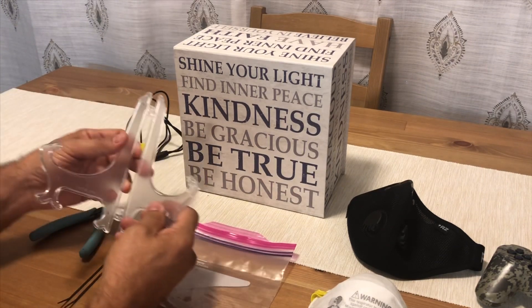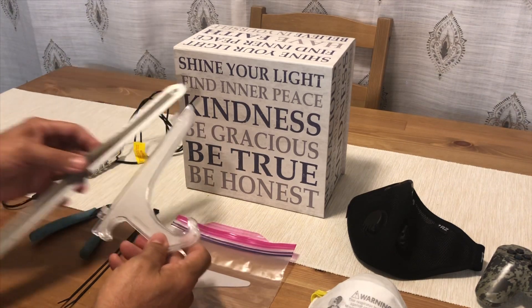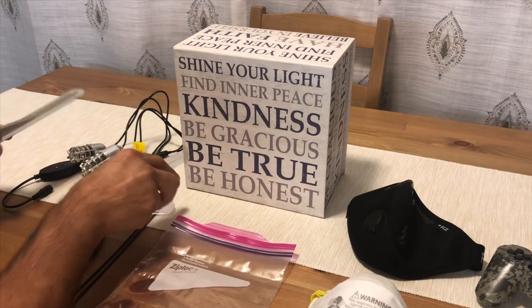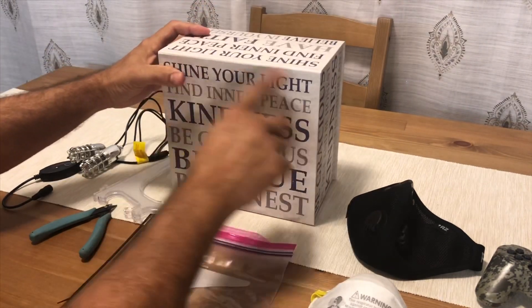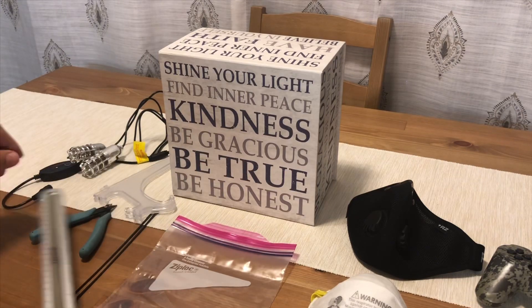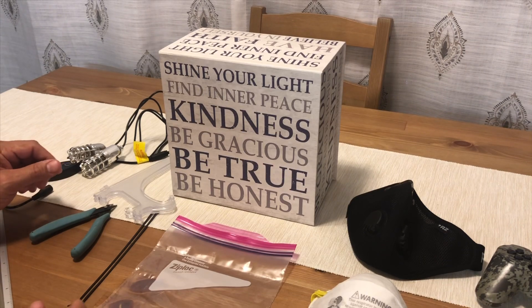This is a picture frame holder. This picture frame holder measures seven and a half inches. There's a box — this box has a magnetic lid to it and measures eight and a half by eight and a half. I have a couple of tie wraps and I'm going to show you how to put this together very quickly.